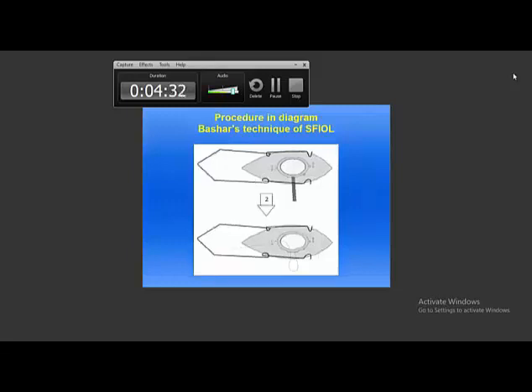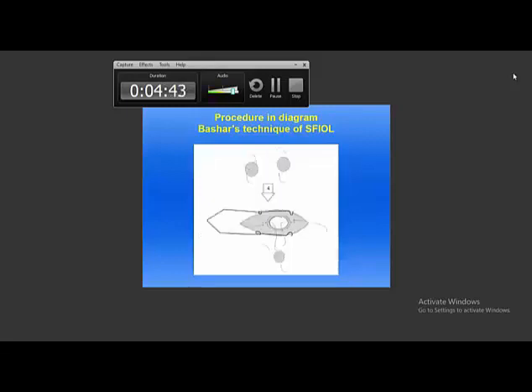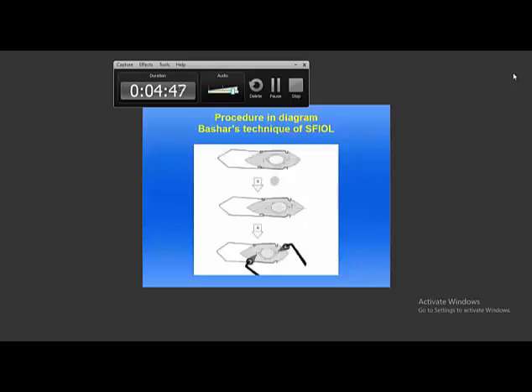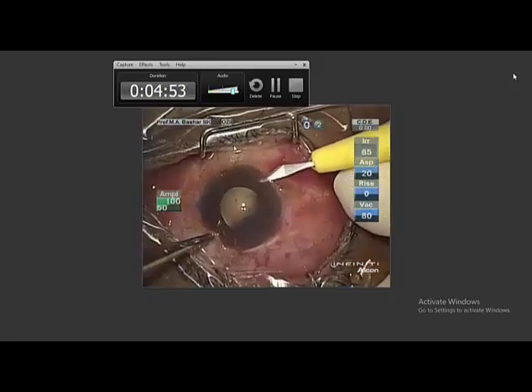First, I make 3 marks, 2mm apart. Then by puncturing the needle and taking out the 5-0 prolene within the wound, and after placing the prolene with the haptic, it is placed within the globe.